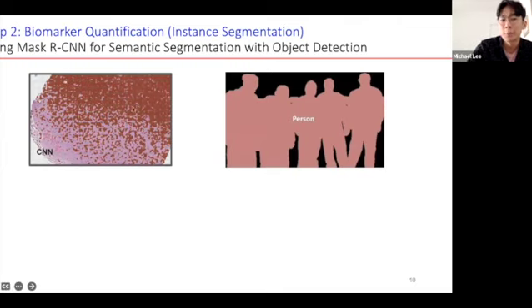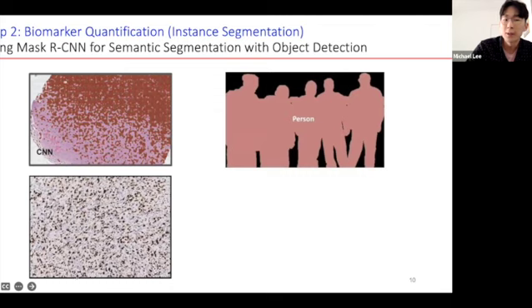Previously, for our H&E-based histomorphologic classifier, we would look at this H&E stained whole slide image and identify what the general classes of the tissue types are. A good analogy would be an image over here with a group of people. This whole group of individuals would be classified as one class, being person. But with a nuclear stain like Ki67 over here, we want to be able to mark each of these nuclei and count the ones that are positive, and the ones that are negative over here in blue in the background.